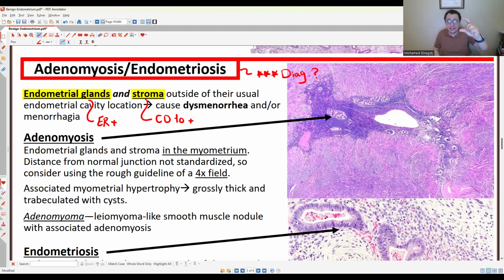Okay? What if you look at the endometrium and you see bland-looking circular glands which are very widely spaced from each other, and you see epithelioid change in the stroma, with epithelioid stromal cells and a little bit of pale pink cytoplasm? So what do you call this? What do we call this?